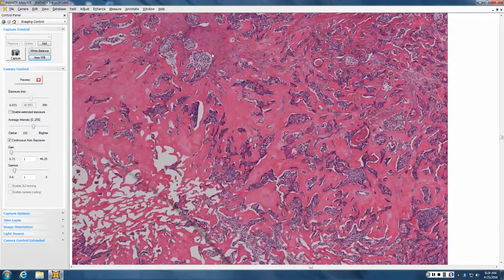So, definitely looks malignant, with angulated islands. Tell me about the stroma. It's really dense and sclerotic. Almost looks bone-like, an osteoid-like stroma, and then the tumor itself has clear cell change and has ducts filled with the bright red stuff. What's that? Sweat. So this is a sweaty tumor with an osteoid-like stroma.